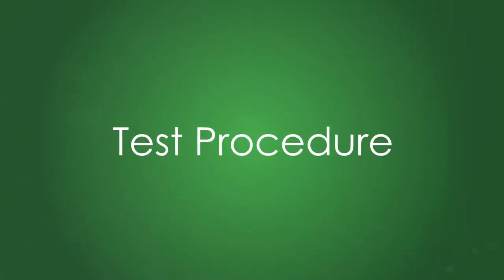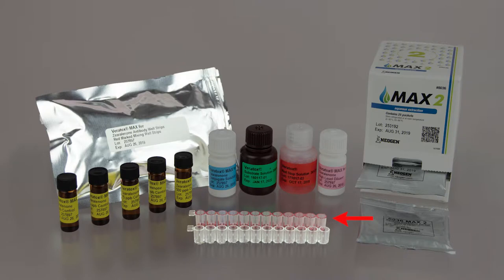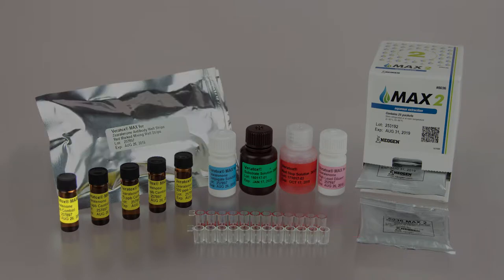Each Veritox Max for Zearalenone kit contains 48 red marked mixing wells, 48 clear antibody coated wells, and 5 yellow labeled bottles of 0, 25, 75, 150, and 500 ppb Zearalenone controls.